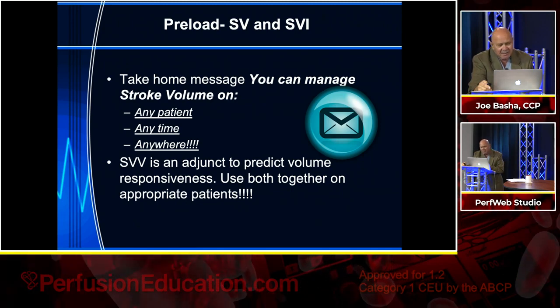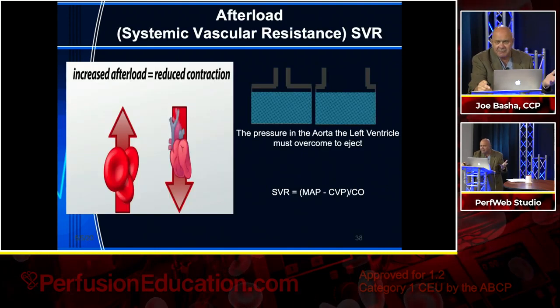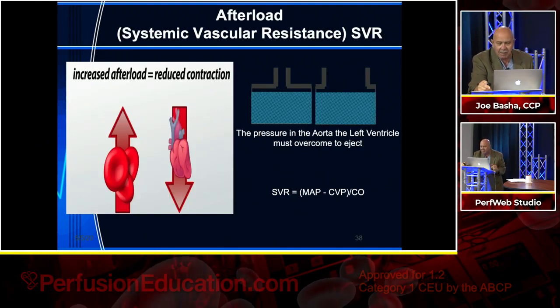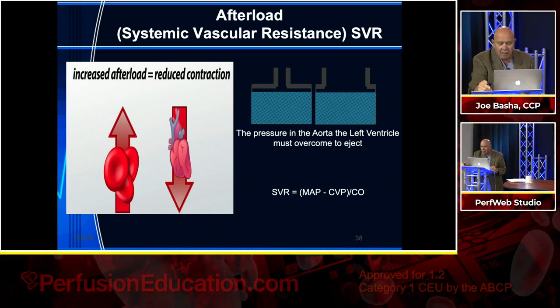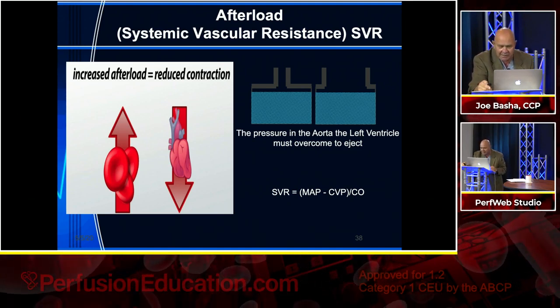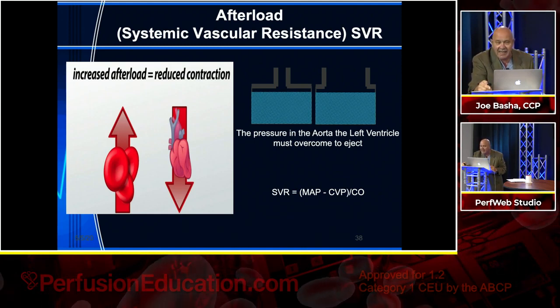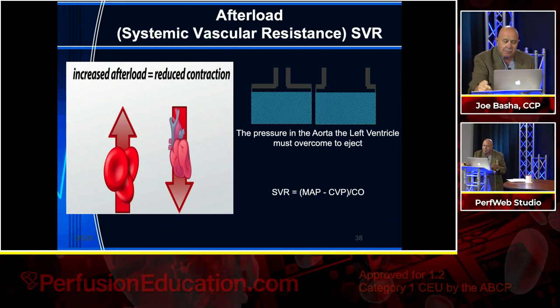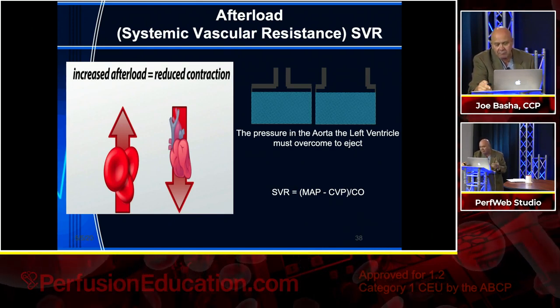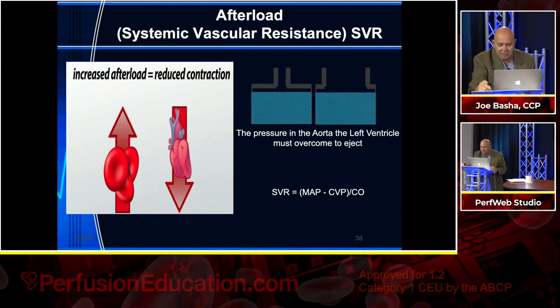And the rest of this, I'll just skip through the slides very quickly. There's an example of high afterload. On the right-hand side, look at that. You can see P1 and P3 are the tanks they're trying to pump. They're like pistons, and you're trying to push it through P2 or P4. Well, you can tell me yourself what you think the pressures are going to be, right?